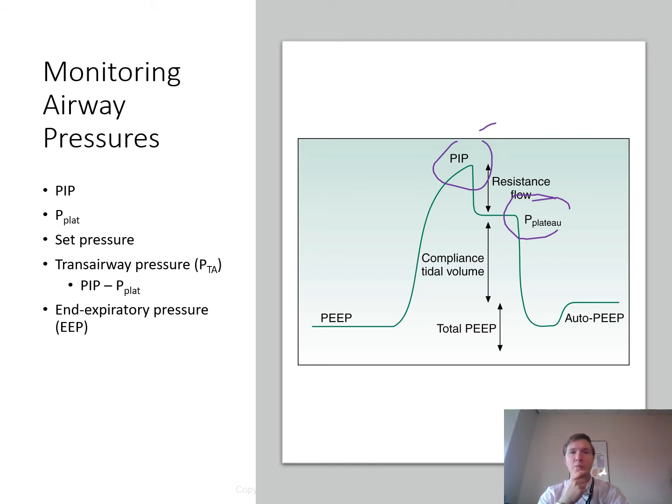Pressure monitoring will allow the clinician to assess pressure delivery to the upper airway. How much pressure are we delivering to the endotracheal tube, right? And then how minimal that pressure is as well, so we can detect if there's any leak. And we can see that high pressure limits do not exceed what the mechanical ventilator is telling us. So we could use these pressure sensors to actually verify our ventilator readings if we have reason to doubt them.